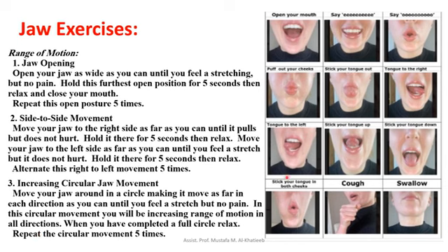Move your jaw around in a circle, making it move as far in each direction as you can until you feel a stretch but no pain. In this circular movement, you will be increasing range of motion in all directions. When you have completed a full circle, relax.